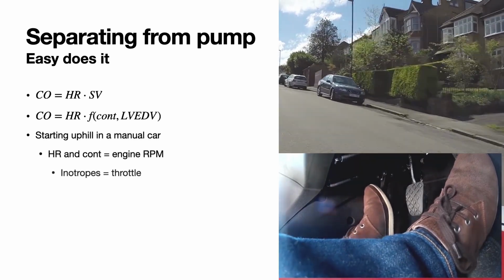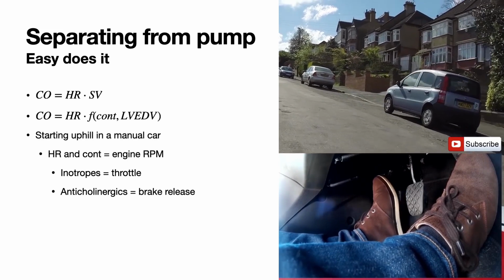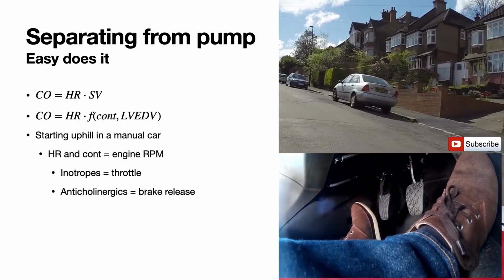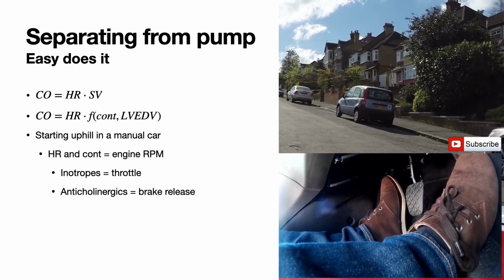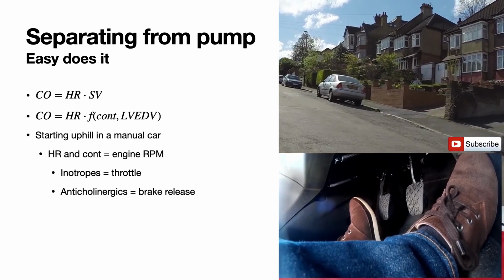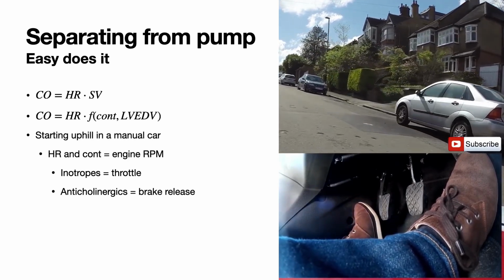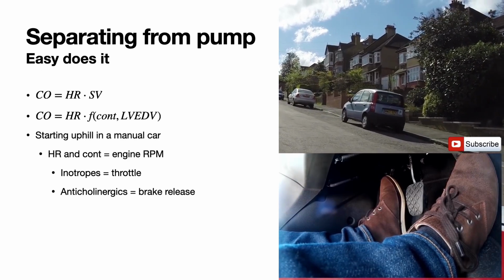Analogously, RPM can be conceptualized as some combination of heart rate and contractility. Ideally, the patient would be in a normal sinus rhythm or even in a slight sinus tachycardia when separating from cardiopulmonary bypass. In the absence of that, a pace rhythm at least guarantees an adequate heart rate. TEE, or visual inspection of the heart, will inform the degree of contractility present.